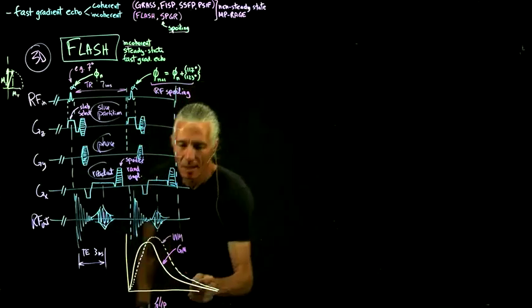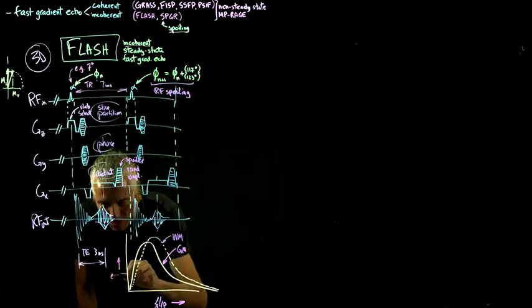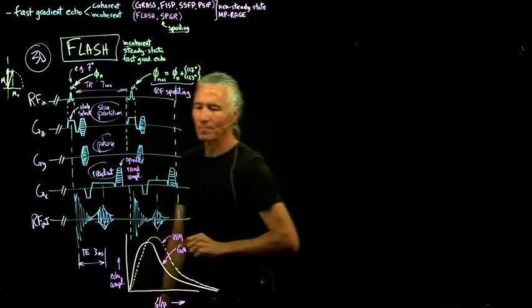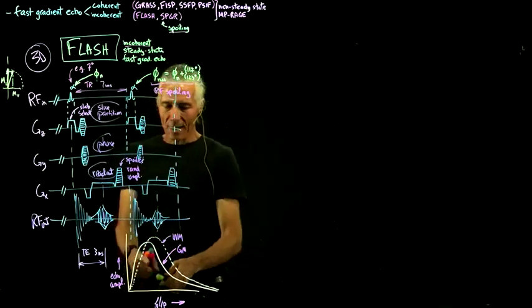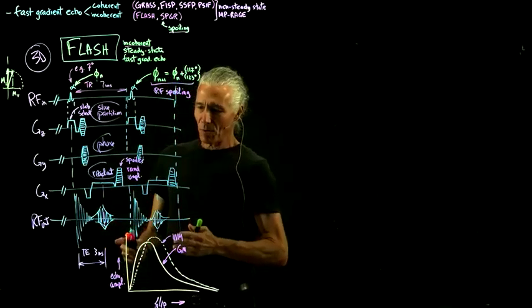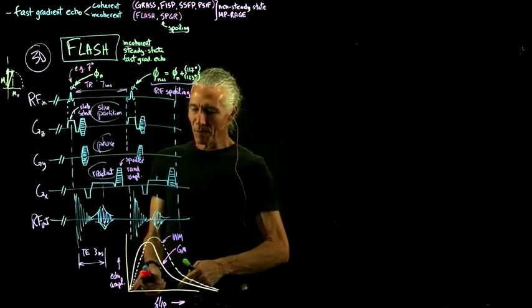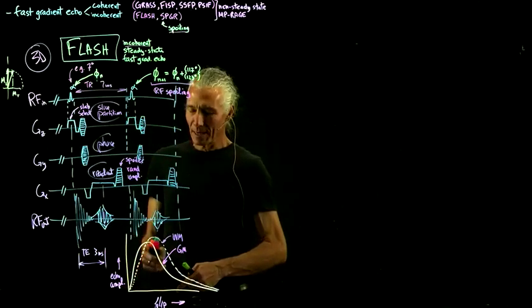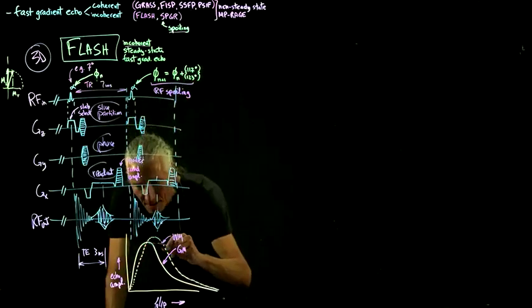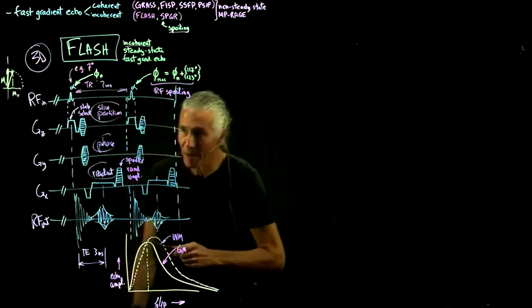And then this is echo amplitude, also known as pixel brightness. What contrast you get with this is quite variable. If you go to a very small flip angle and a very short TE, you can get proton density. What if you pick this one? Well, then you would get zero contrast between the gray and the white matter.